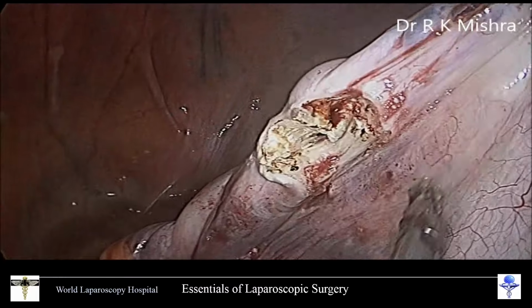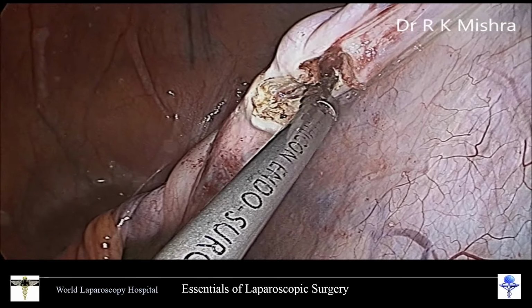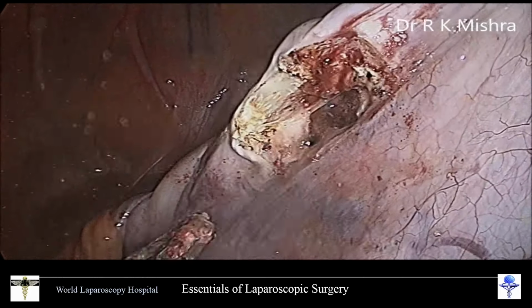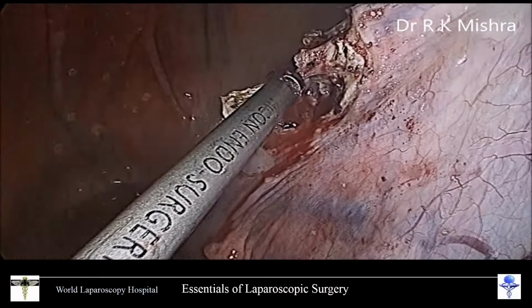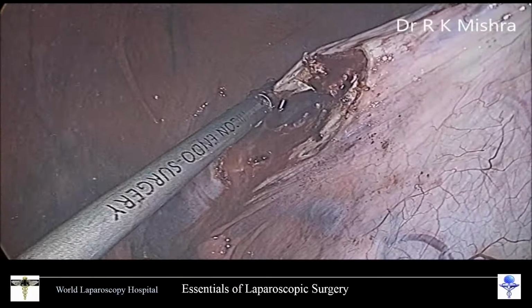Actually, if you see in this patient, the cyst is left-sided, but the surgery is going on the right side, because it is too huge and too mobile that you can bring it to the opposite side also. The infundibulopelvic ligament in these patients also gets a lot of stretch.